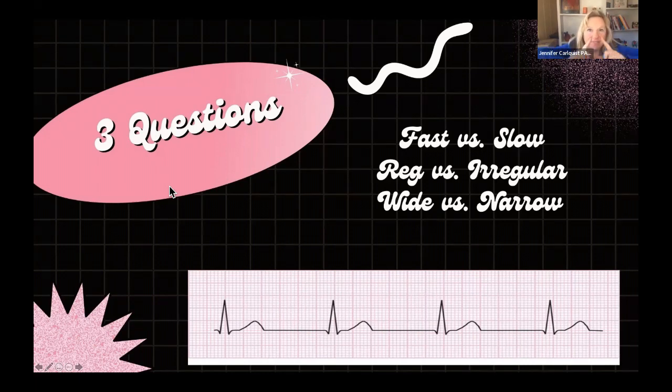Okay, so I love all the conversation that's happening right now because we're critically thinking about this, right? And I will agree with you guys. I think everybody agrees there's no P wave. So we know the sinus node's not in charge. We also know that the rate is probably around 40, okay? And we know that idioventricular rhythms are wide, okay? So idioventricular versus junctional, this is the big question, right? What is it? Because junctional and idioventricular would not have a P wave.